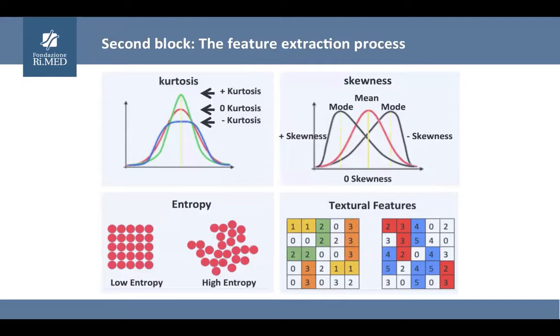In the second step, we used Mazda software to calculate features starting from the ROI obtained using the above-mentioned segmentation process, extracting a total of 219 radiomics features for each MRI sequence. Features are divided into first, second, and third order, providing information related to the gray level distribution within an ROI without considering spatial relation between the voxels (first order), considering the spatial relation of voxels (second order), and evaluating spatial relation among 3 or more voxels (third order).